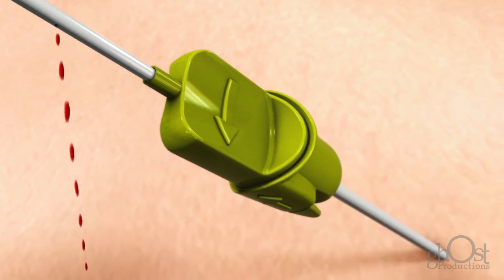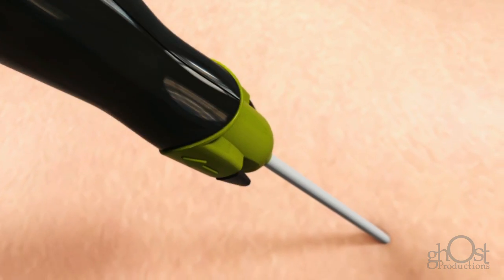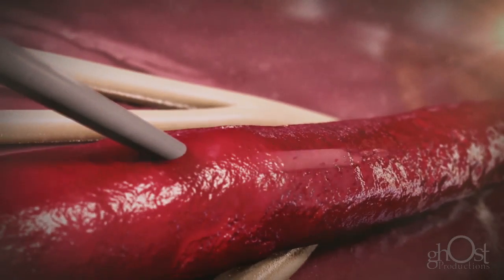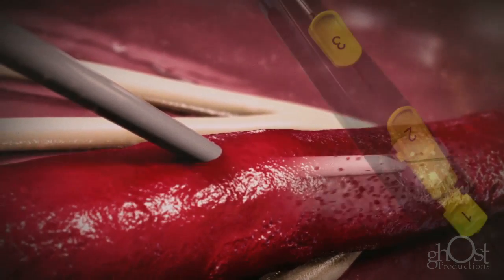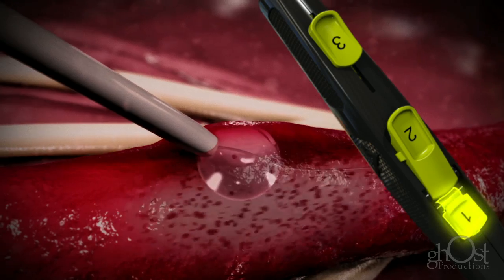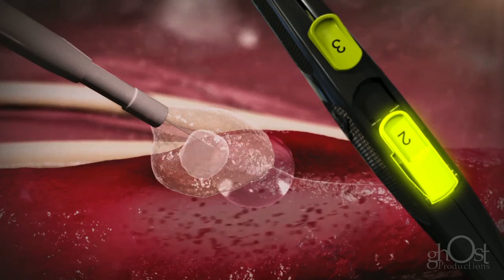The Minx Ace is positioned in close proximity to the arteriotomy. The semi-compliant balloon provides temporary hemostasis. Sealant is placed gently on the arteriotomy.